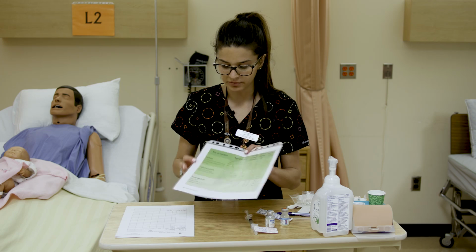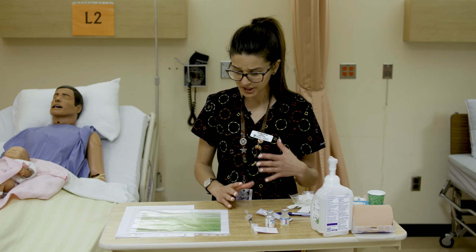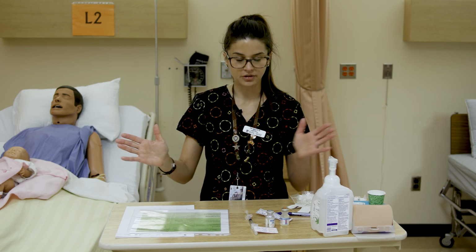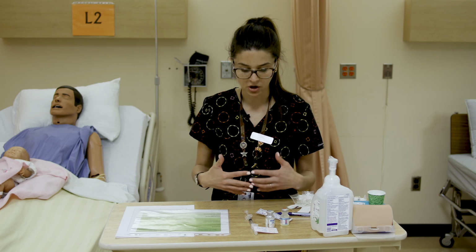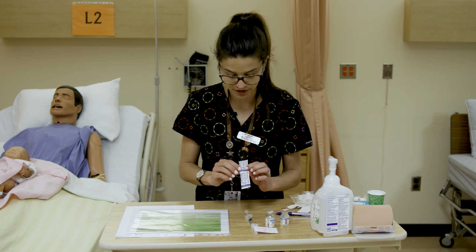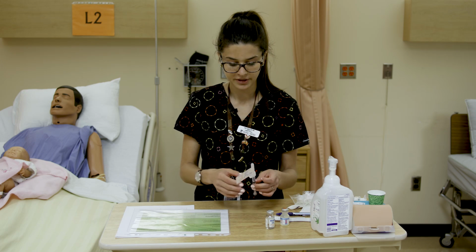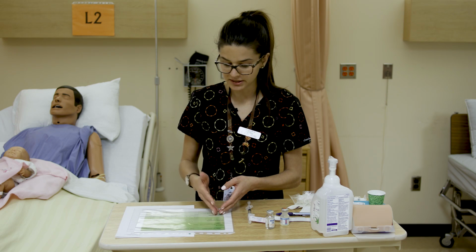So there are lots of really helpful guides and charts out there for you to plan that or understand. But generally speaking, about 5/8 or even 1 inch. For adults, about 1 inch to even up to 1.5 and 2 inches is your wiggle room to work within, depending on the site. And then 22 to 25 gauges are the most common gauges for intramuscular injections. So we say we have an average sized patient. We chose a 23 gauge 1 inch needle for that, so we'd want to make sure that we have the right needle.